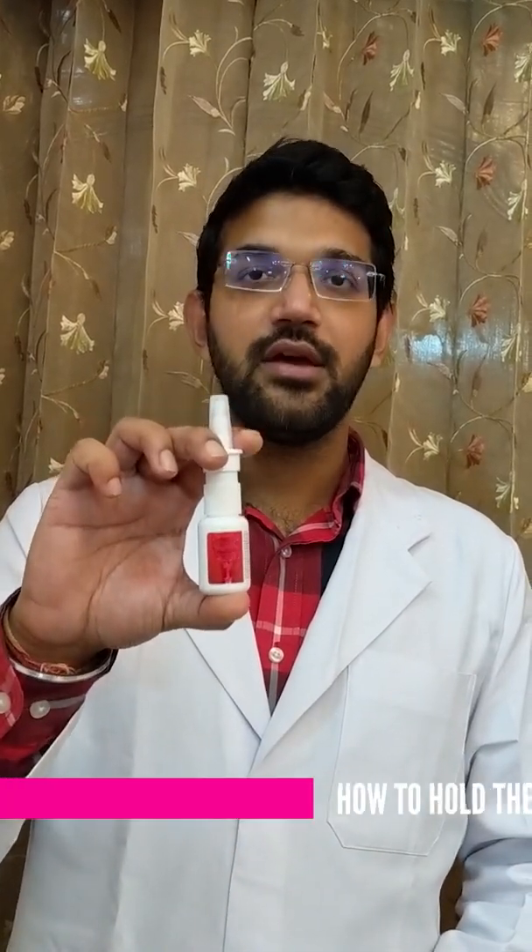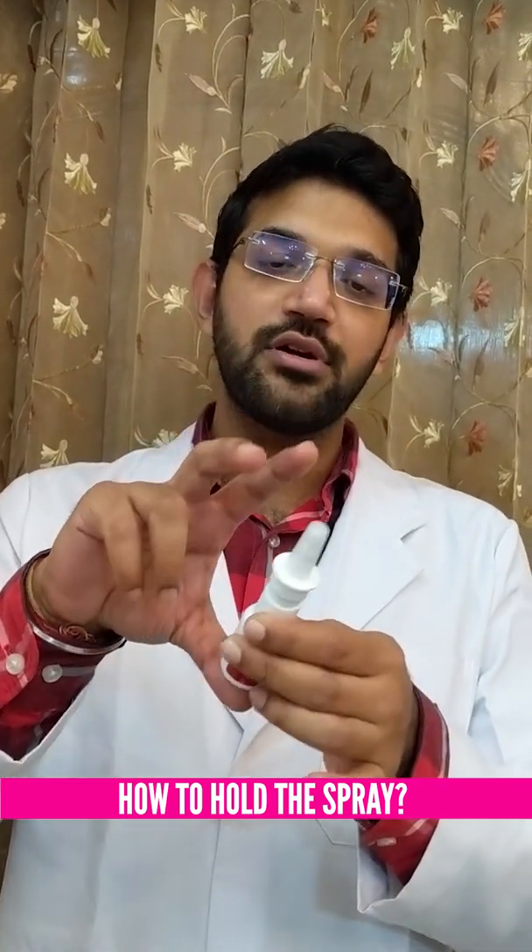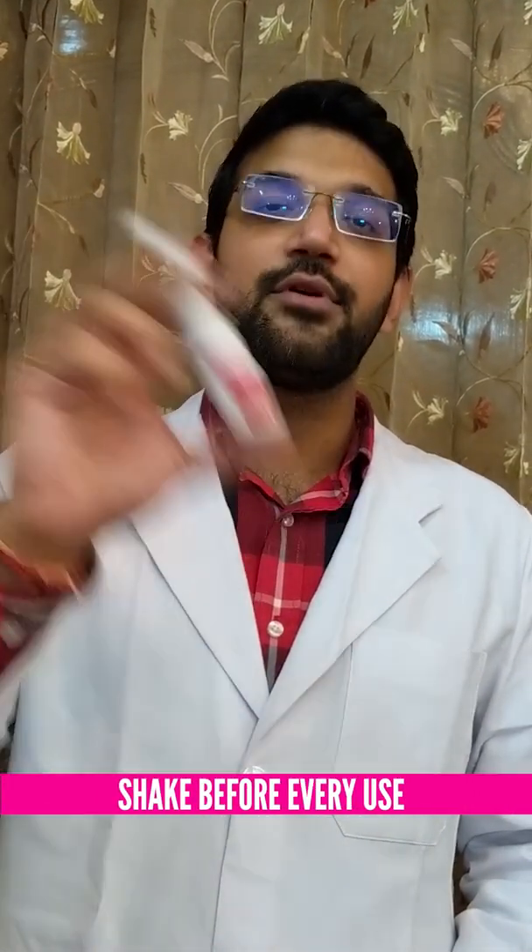This is the nasal spray. To hold the nasal spray, we keep our thumb at the lower part and both our fingers around the nozzle. First of all, we need to shake the spray approximately for 10 seconds.